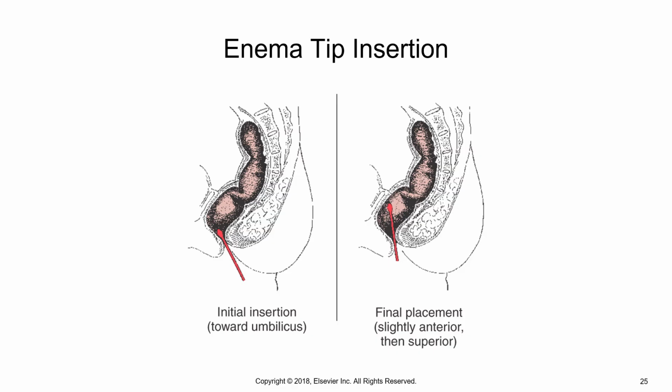If you're a female, it would be no different than inserting a tampon. You're not thinking about the direction. You just kind of put it in there, and then it follows the path of the patient's anatomy. The enema tip does the same exact thing. This is not super thought involved, but when they ask you how is the enema tip inserted directionally, you would want to say it's inserted up and towards the umbilicus.